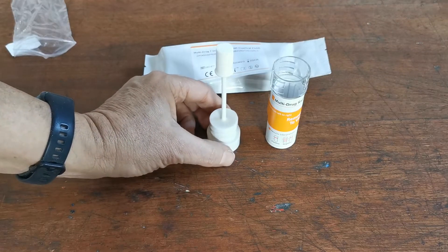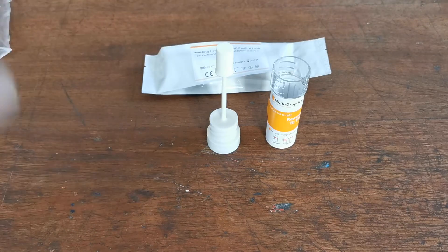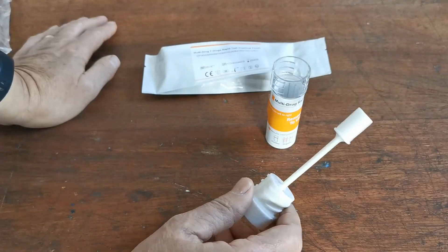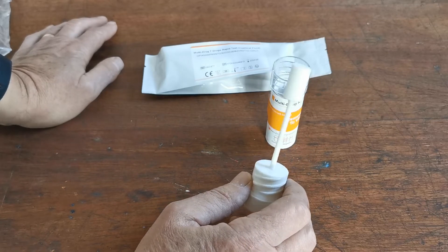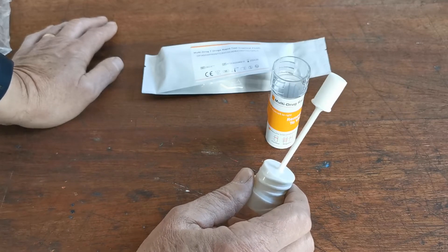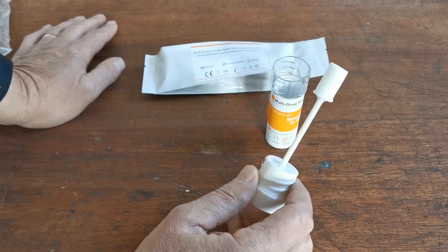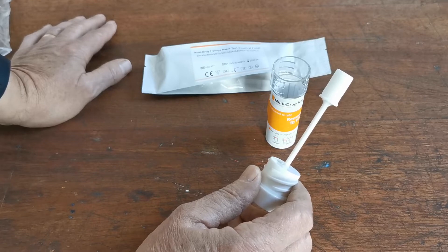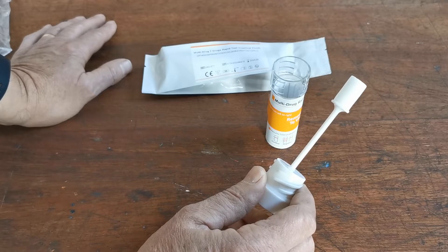It is very important that the swab is not just saturated passively in the mouth. Once it starts to soften, it's important to work it around the mouth completely, collecting any residue — particularly of cannabis — because the saliva swab test will only screen for parent cannabis still deposited around the oral cavity from exposure. When soft, ask the candidate to move the swab between the teeth and cheeks, above and below, front and back.